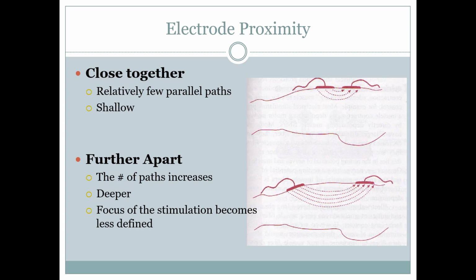To date, there are no documented cases of any spinal damage, injury, or even stimulation with the application of superficial electrode placement around the spine. The simple fact that electricity will follow the path of least resistance, which is going to be at a superficial level. In addition, the depth of the spinal nerves and the protective surrounding soft tissue and bony tissue make the spine a relatively low risk. However, it is completely up to the clinician to determine the treatment that they are comfortable providing.